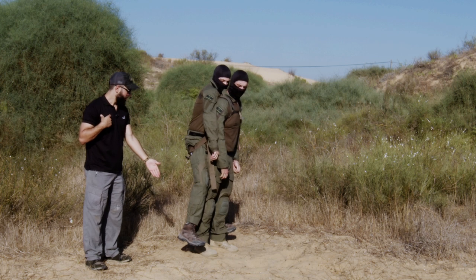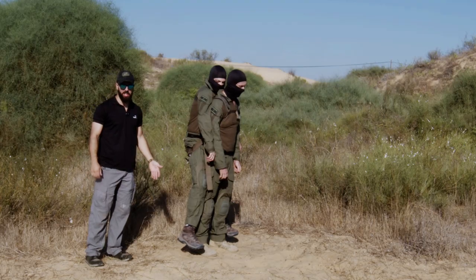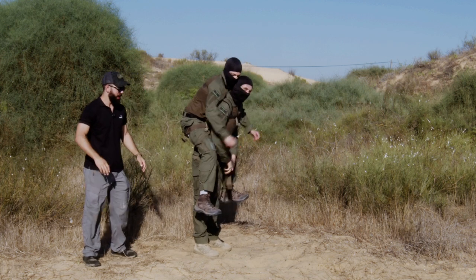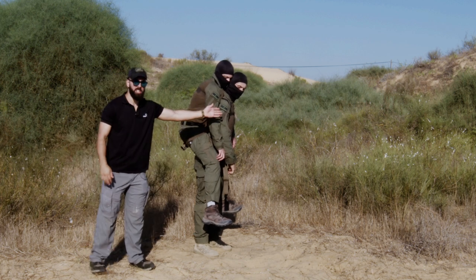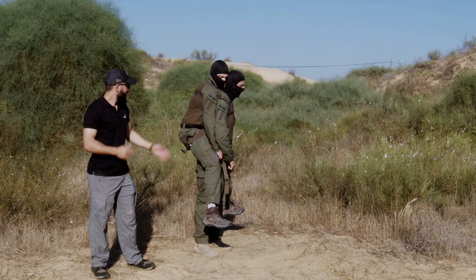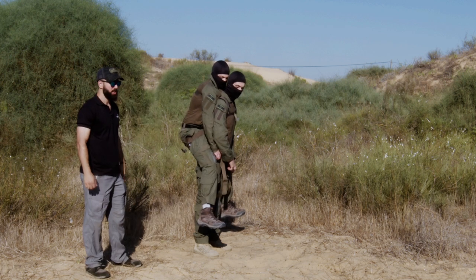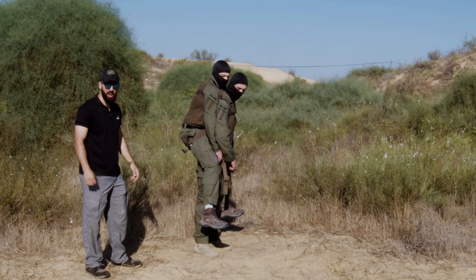In this situation it works perfectly because of their height — the feet aren't on the ground. If the person you're carrying is much taller and their feet are dragging, you can pop them up into more of a piggyback position, jump them up a little bit and their feet should be up and off the ground. In this position, person A is free to use a weapon and can more easily traverse the terrain. Since the strap is already on the person, if they get tired they can just take it off and someone else can put it on.